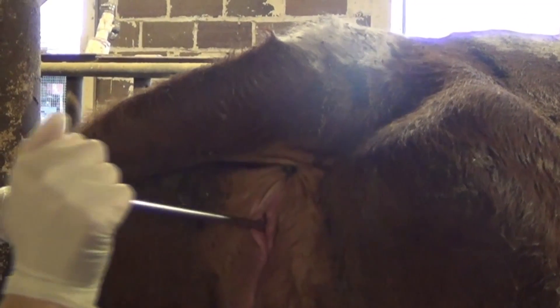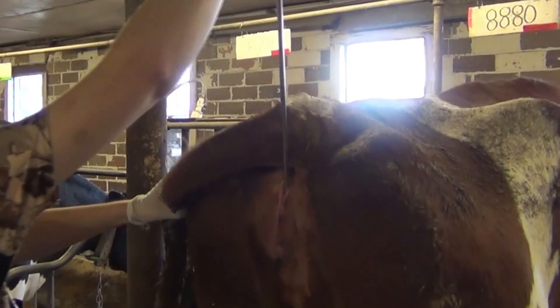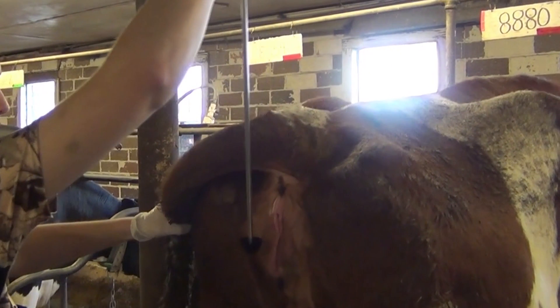From here, you want to slowly pull the MetroTech device outward at an upward 30 degree angle to ensure that the vaginal discharge remains in the hemisphere of the MetroTech device.